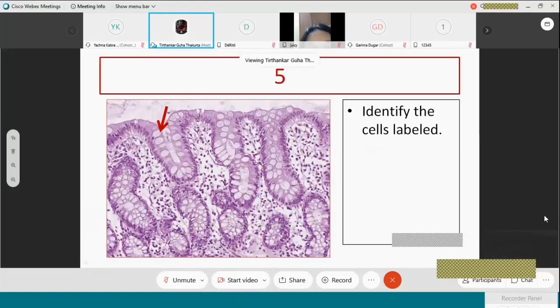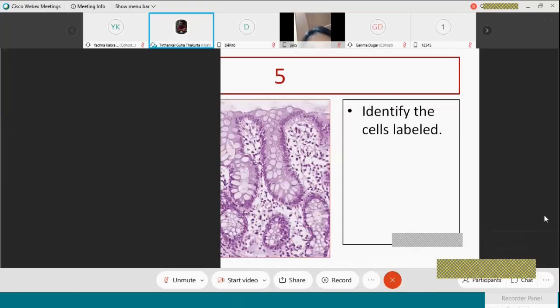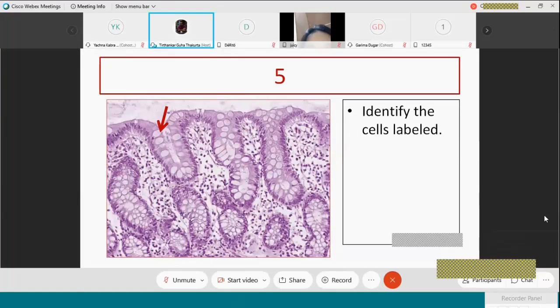On the other hand, if a gland contains zymogens, which usually take up strong basophilic or some kind of eosinophilic stain, then those colorful cells lining the gland are likely to be a serous gland. So a gland can be termed as serous or mucinous based on its appearance also. If the appearance is pale, it definitely contains mucin. If the appearance is colorful, it contains stainable proteins, and therefore it might contain zymogens, and it might be a serous gland.